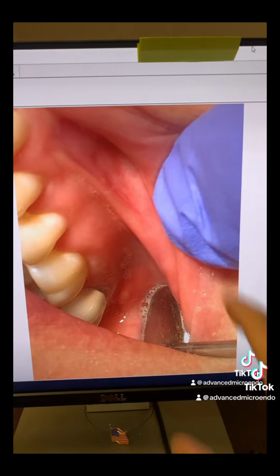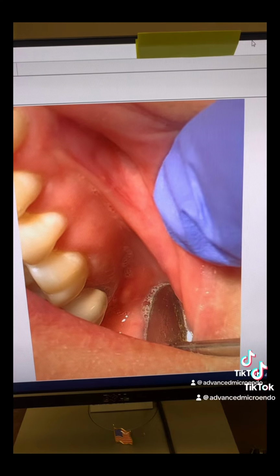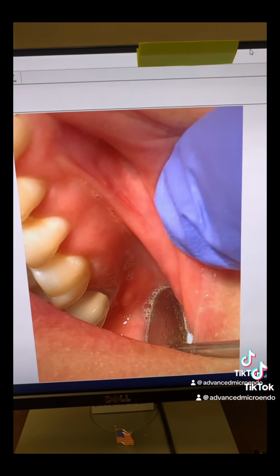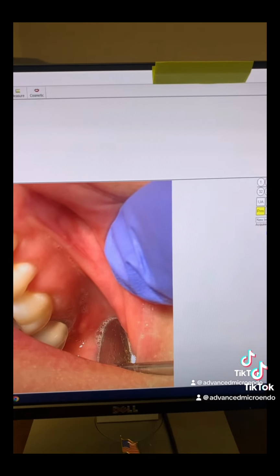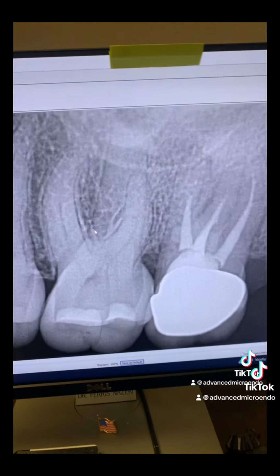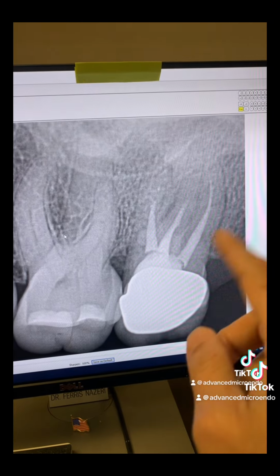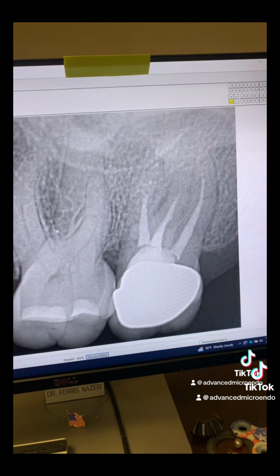Okay. So the patient says the swelling was much larger, and her dentist put her on antibiotics and the swelling went down, but I can see the remnant of it right there. So again, you can see there is no periapical radiolucency. Really none here. Why did this root canal fail then? What is that sinus tract draining? Where is the periapical radiolucency?